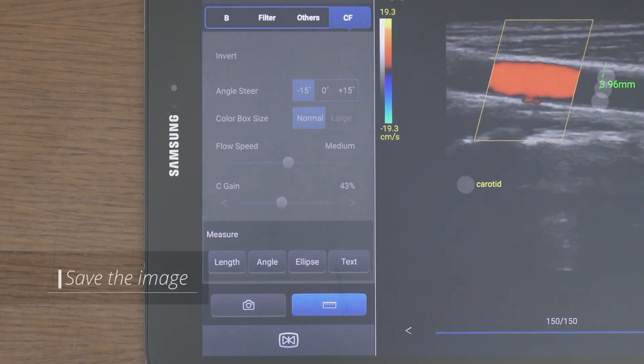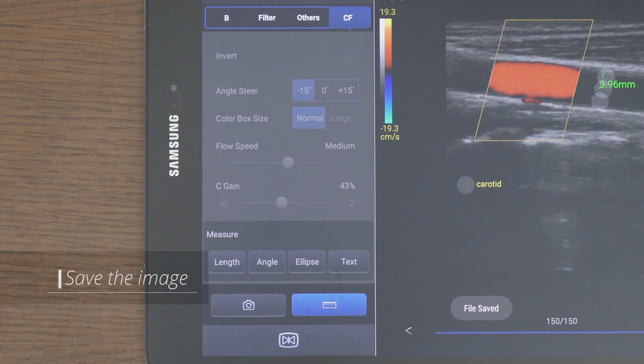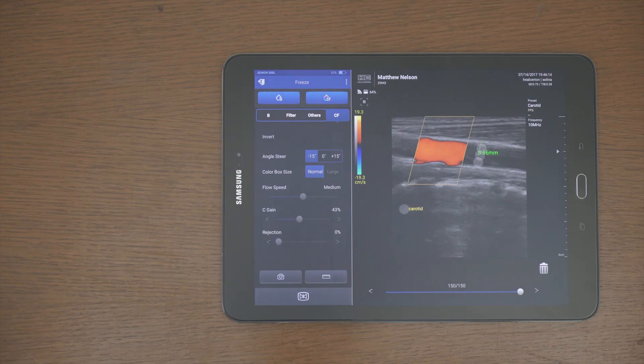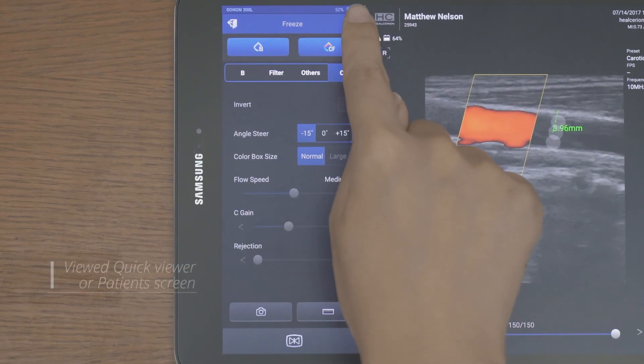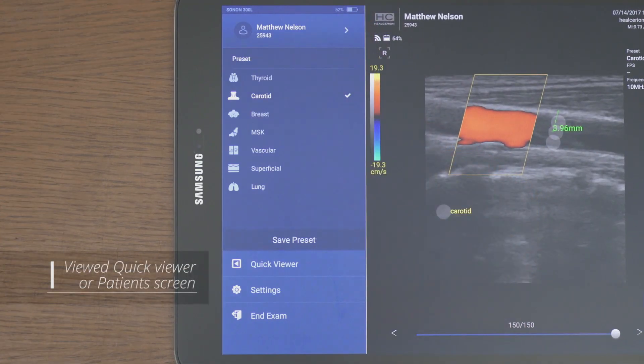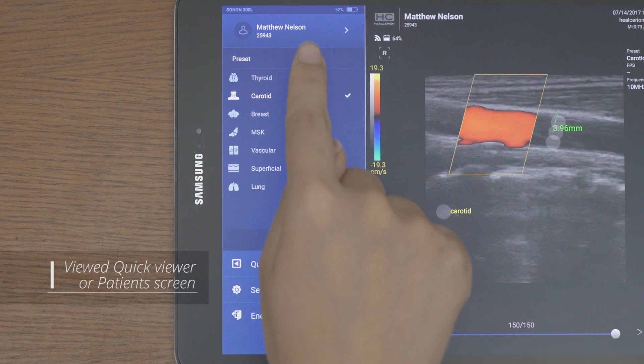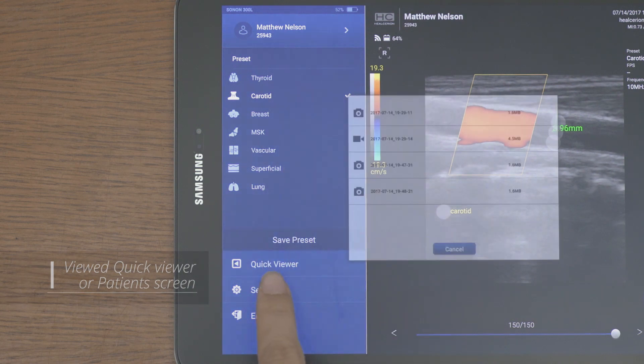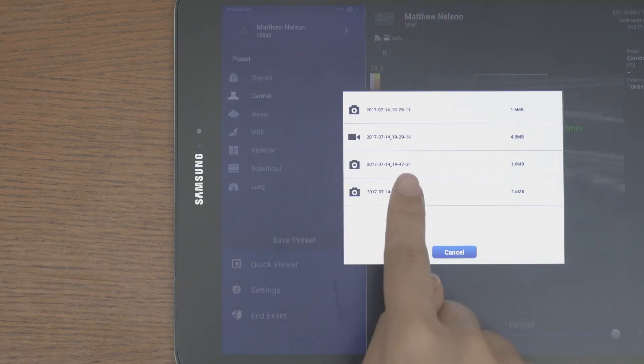Use the camera button to save the image. Saved images can be viewed in the quick viewer or patient screen in the patient list.